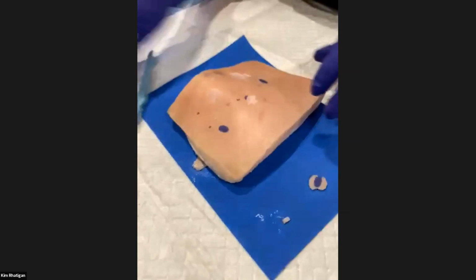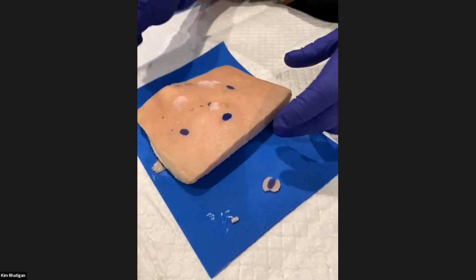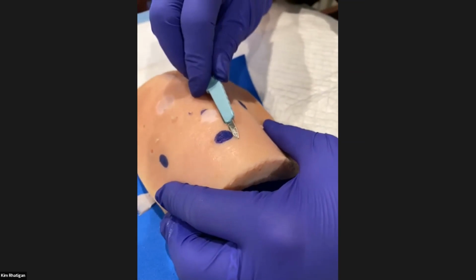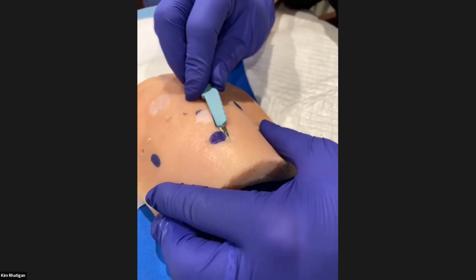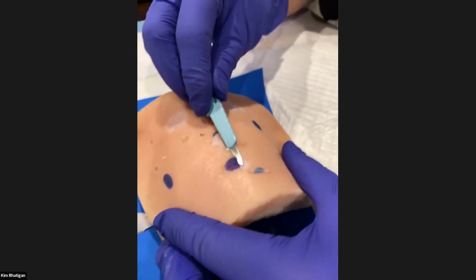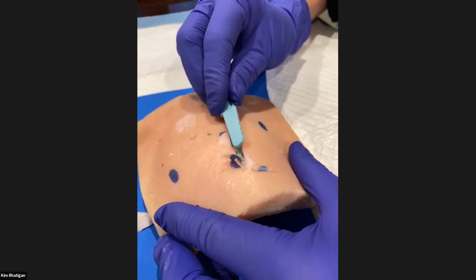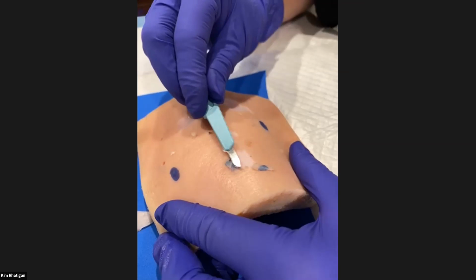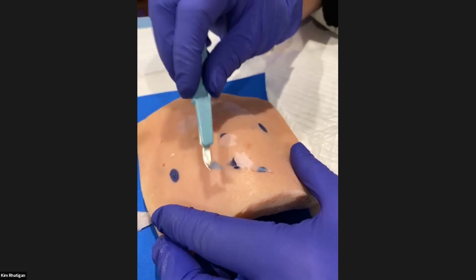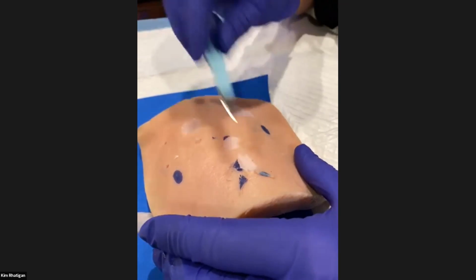Let me make another spot here, more in the middle. This Sharpie doesn't work well on the salt on the skin, so it helps if you wash the skin and dry it beforehand. Oops, I got a little shave, so I got some of my lesion out. You're pushing instead of slicing. Yeah, you're right. So this was a botch right there. That's not a good example. This is why we practice, because this pig is not going to be upset tonight by my work.